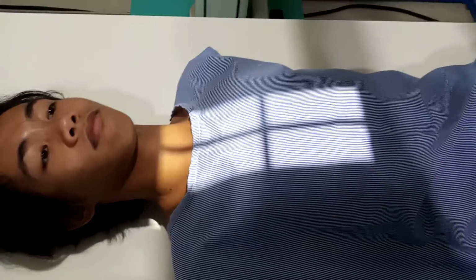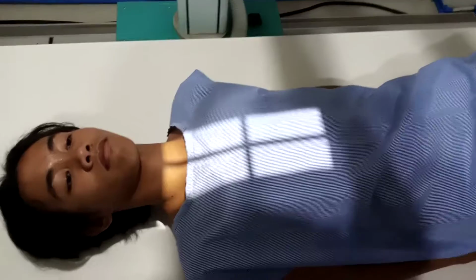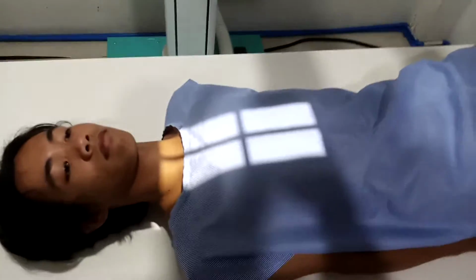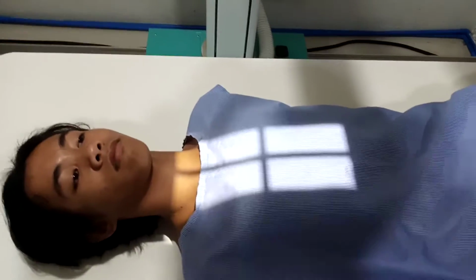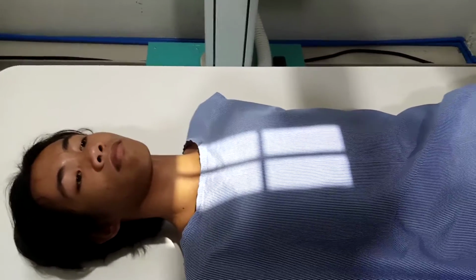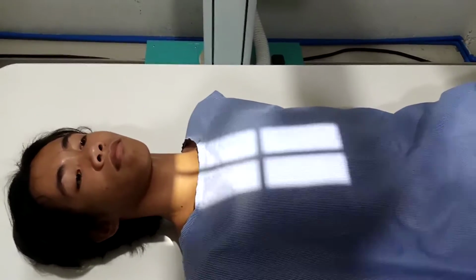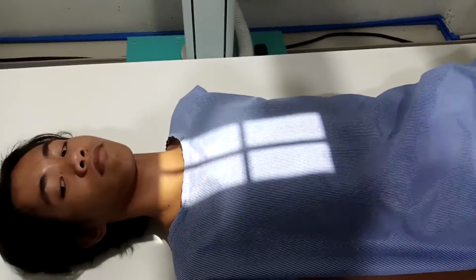There should be no rotation, indicated by sternoclavicular joints equidistant from the spine. The collimation of the area of interest must be clearly demonstrated. Exposure should clearly demonstrate the bony margins and trabecular markings of the thoracic vertebrae. There should be no motion seen on the final radiograph.